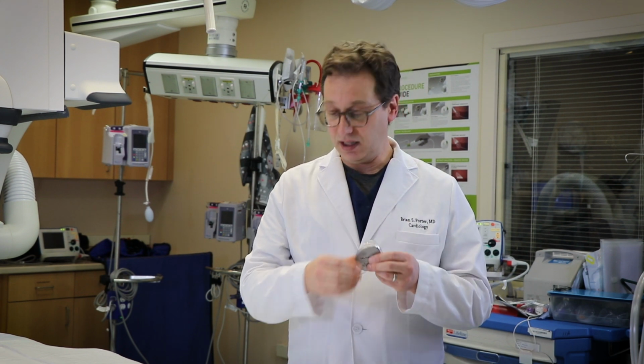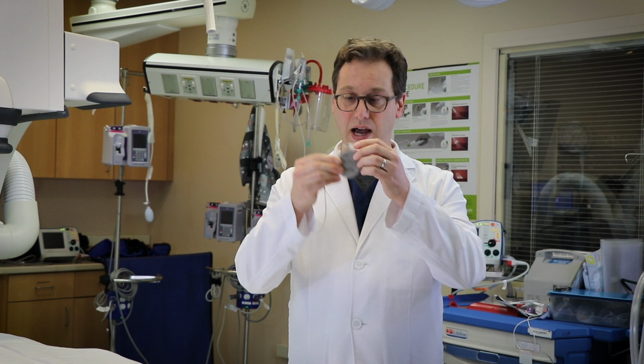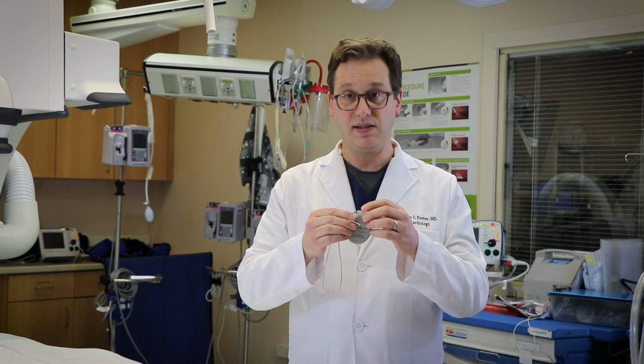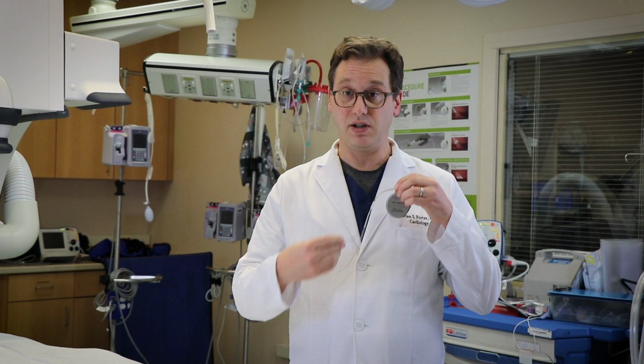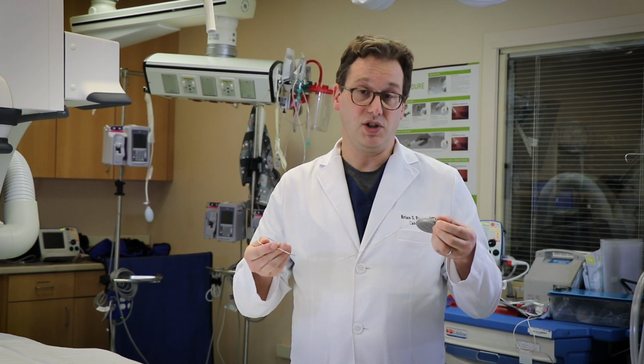It works completely automatically through a wire that is, again, inserted under the skin and connects the brains and the battery pack to the heart. Now, if the device senses through this wire that the heart is beating too quickly, the device can send an electrical impulse or series of electrical impulses down to the heart to restore normal function and save a person's life. So again, most patients don't need these, but some patients do. This is a procedure that we can do here at Exeter Hospital if you need it in order to help you live a nice, long, safe, healthy life.